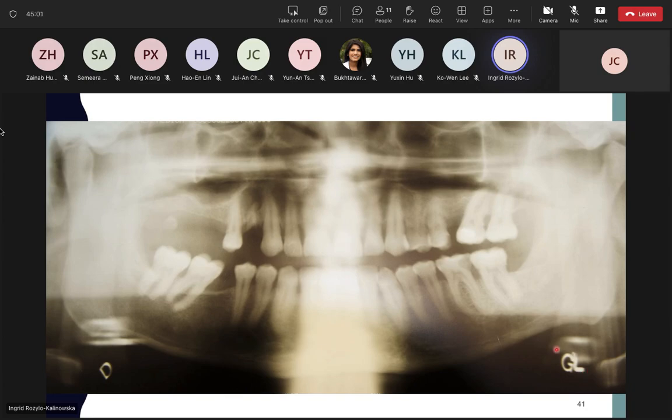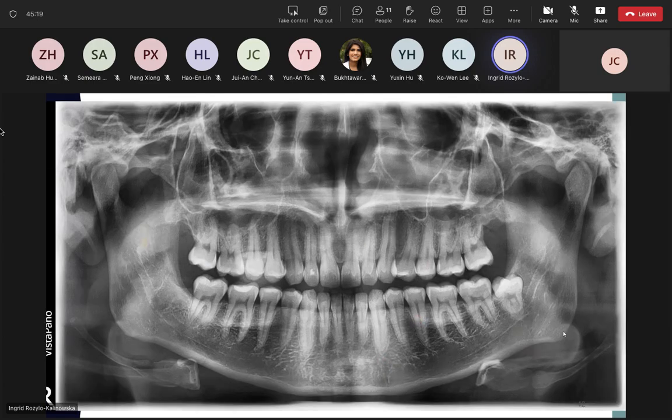And these two metallic letters produced a very big ghost shadow cast on the image of contralateral angle of a mandible. So we really have traveled a very, very long way in technology of panoramic radiography. So this one is extremely clear and I'm sure much nicer for interpretation than the previous one.